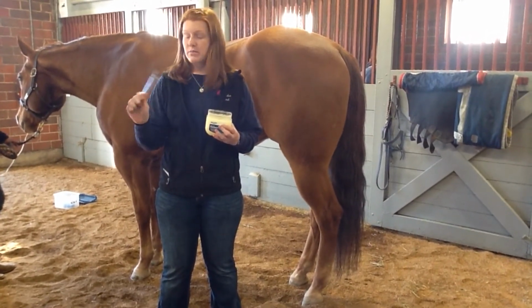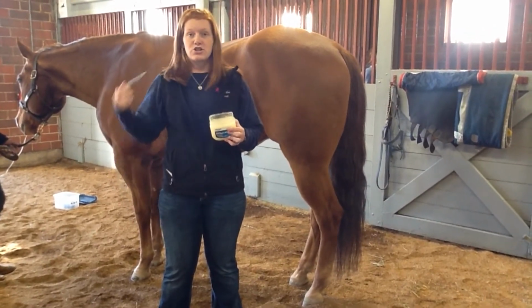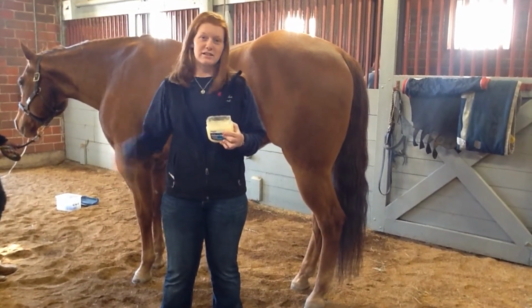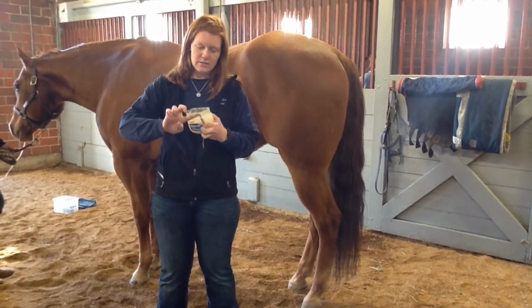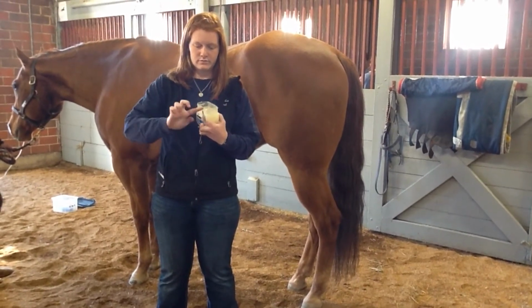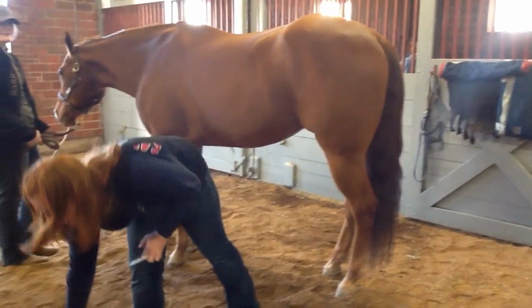You're going to want to hold your clip in your hand and hold the end of your thermometer, and you're just going to shake it hard and semi-aggressive. Just don't throw it and break it, because then you're out of thermometer. So I'm going to take my finger and coat it in Vaseline and cover my thermometer. I'm going to set my drawer down out of the road.